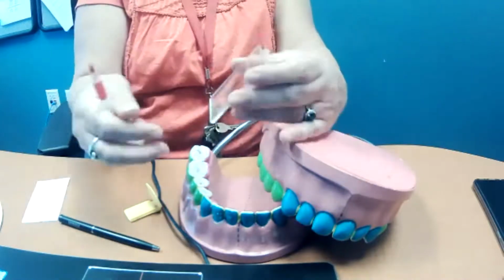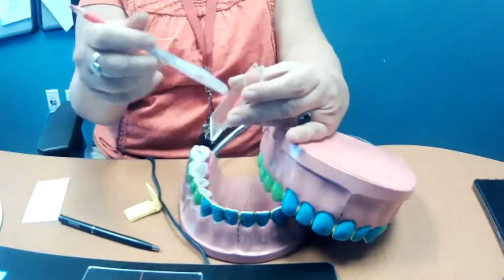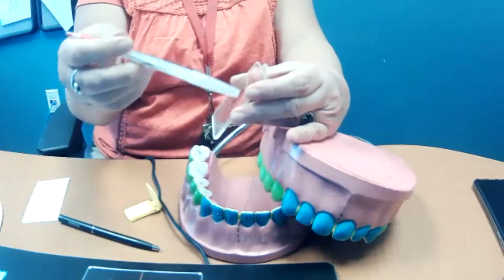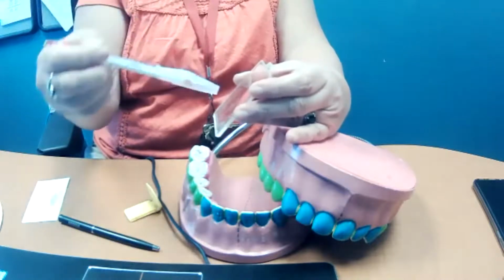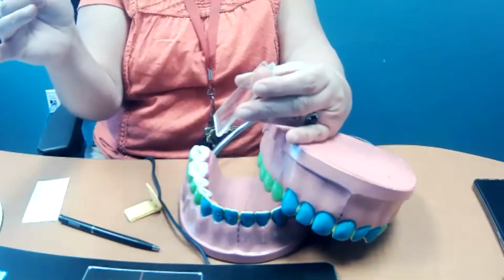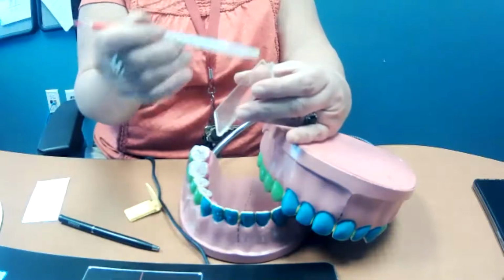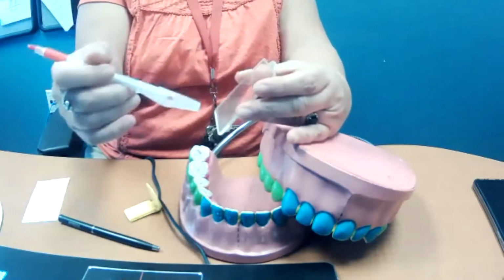I hope that helps. But that's also why we've been talking about getting the perfect quality of X-ray. What we want is the tooth to be exactly like it is in the patient's mouth. We don't want any changes from the length of it at all.